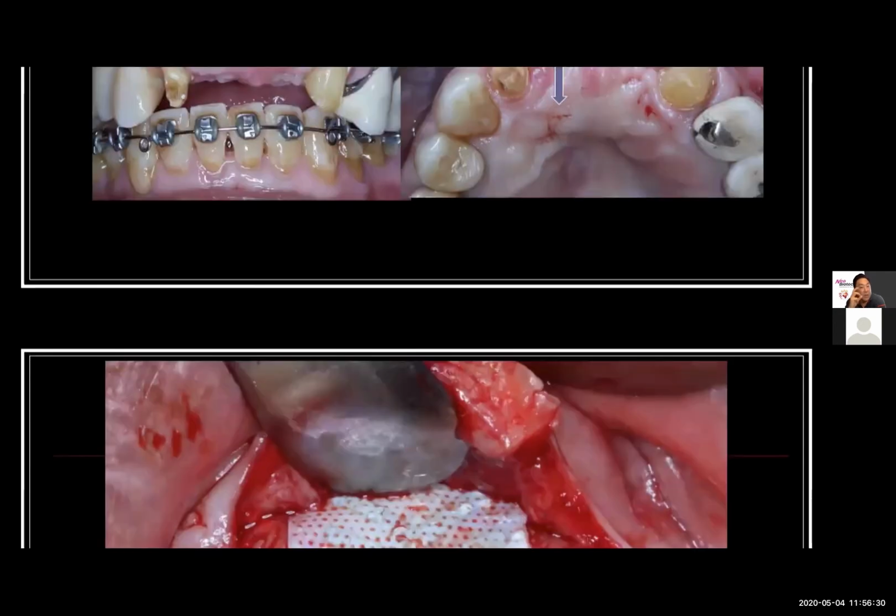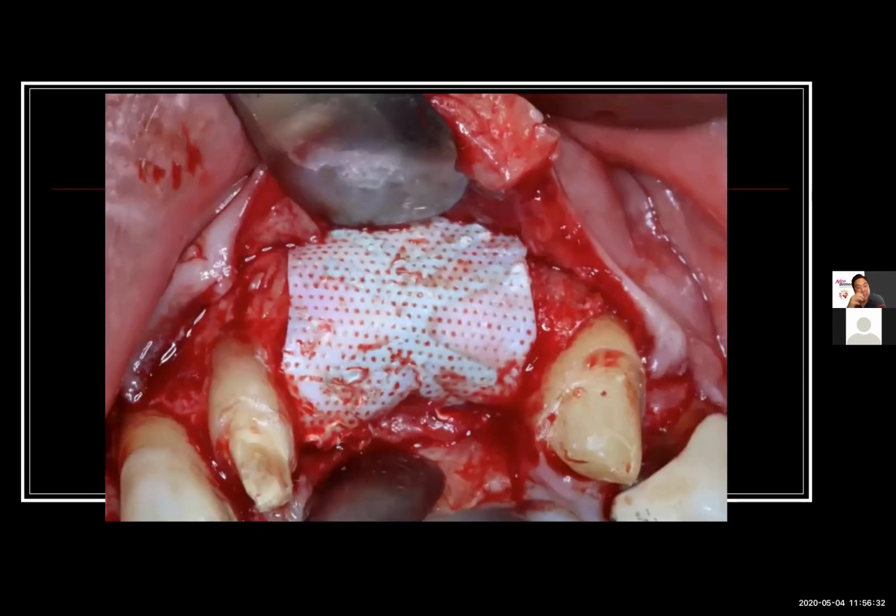And so the question is, do we have bone underneath? There was no exposure, right? So now we go to uncover and expose the bone. This is the true telltale moment that we've been waiting for to see. Do we get regeneration? Do we get the amount of bone in terms of not just horizontal, but vertical, which is what we're looking to achieve?